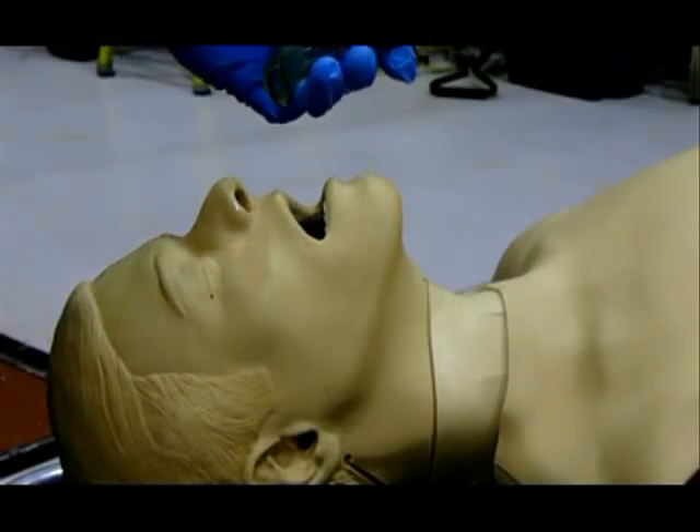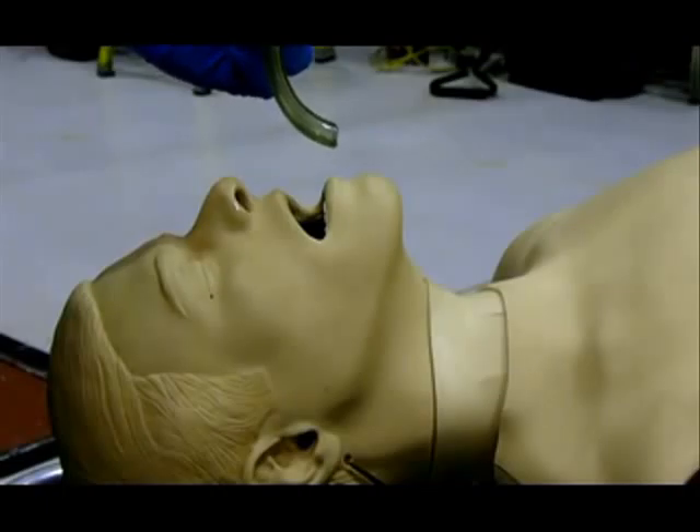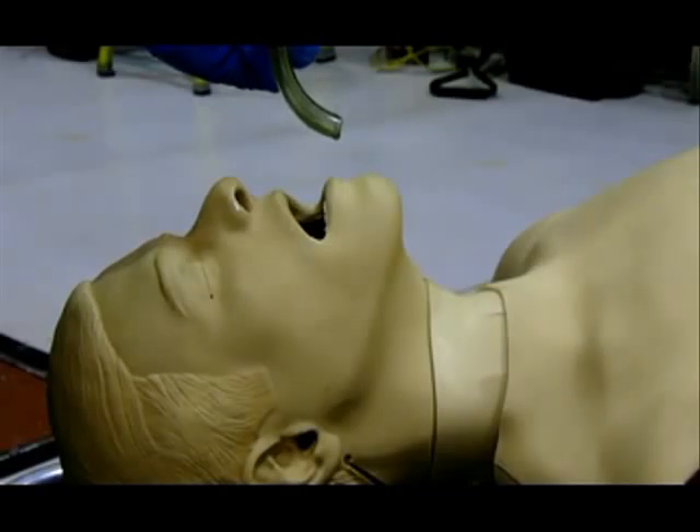Indications for the use of an OPA: an unconscious or semi-conscious patient without a gag reflex who cannot protect their airway and may require manual ventilation, and as a bite block to protect the endotracheal tube after intubation. Contraindications for the OPA are patients that have an intact gag reflex.